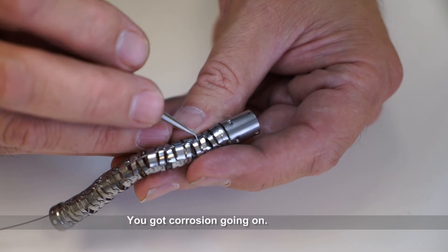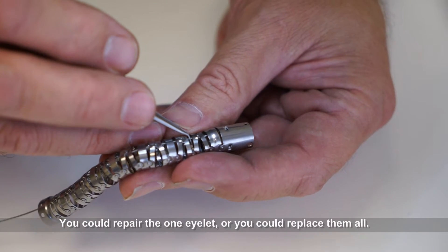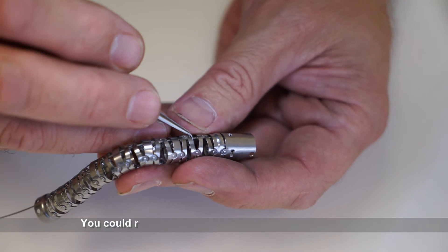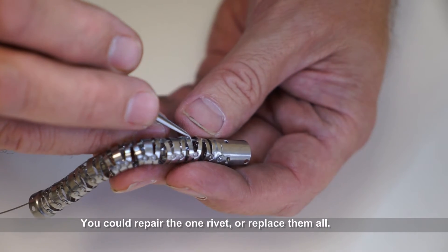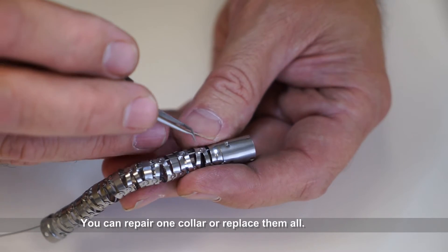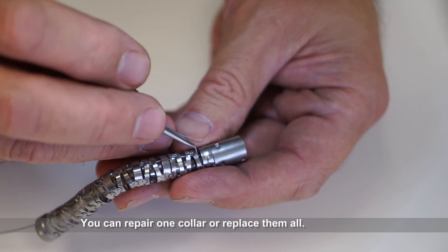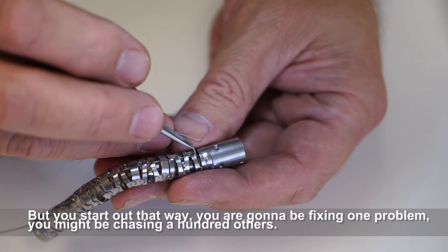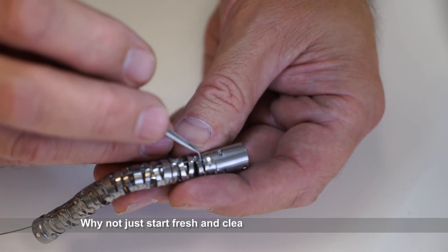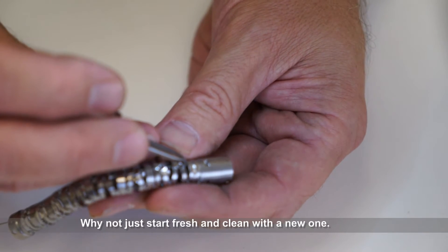You've got corrosion going on. The eyelet that came off is an indication that there are other eyelets maybe coming off. You could repair the one eyelet or replace them all. You can repair the one rivet or replace them all. You can repair the one collar or replace them all. But if you start out that way, you're going to be fixing one problem and might be chasing a hundred others. Why not just start fresh and clean with a new one?